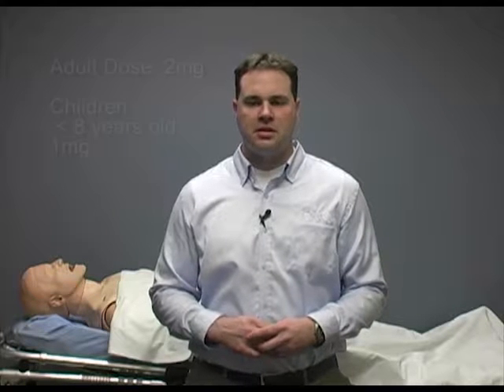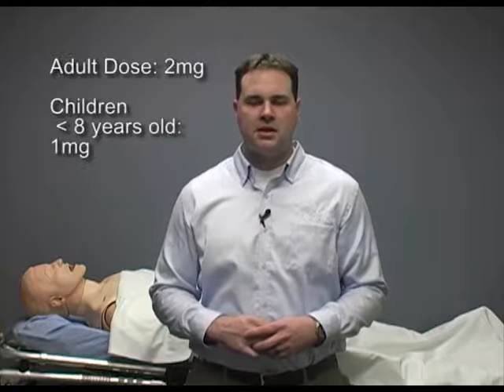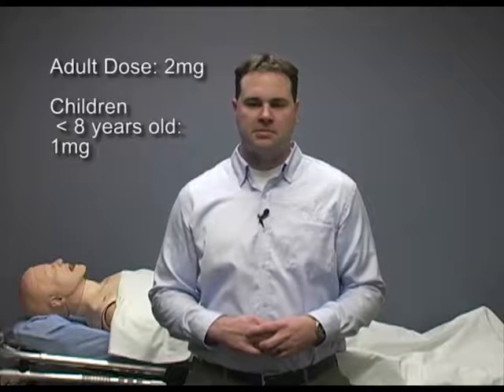The right patient is generally straightforward in EMS, but can get complicated with multiple patients. The right medication is Narcan. The right dose depends on the age of the patient — an adult dosage is two milligrams, while a child under eight years old is one milligram.